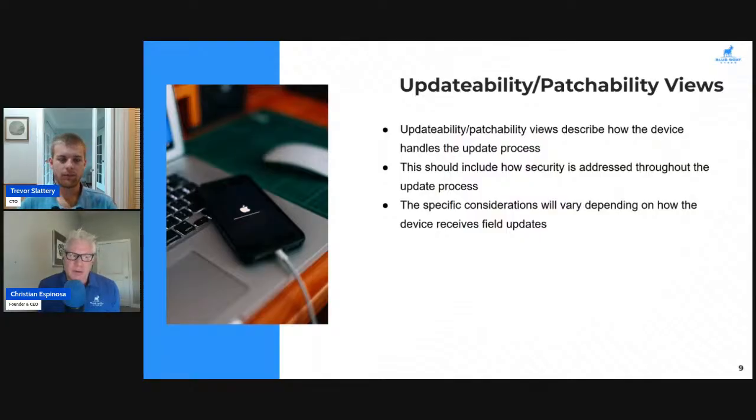Yeah, I remember one of our clients there, because you mentioned the infrastructure that supports the over the air update. They had their over the air update infrastructure connected to their corporate environment, which obviously is not a secure updatability or patchability environment, because the HR person is sitting next to the person, logically on the same network, to the person that's developing the update. So that's one of the things we have to consider also if we do an OTA, right? Definitely. We want to make sure this is an isolated process outside of anything else.